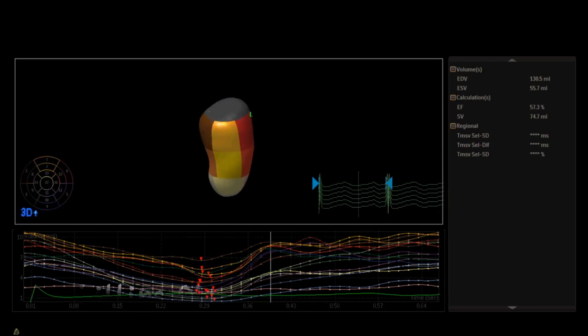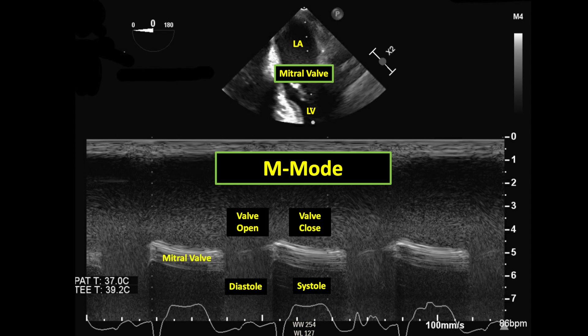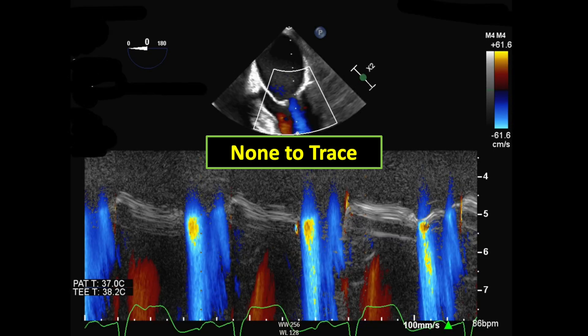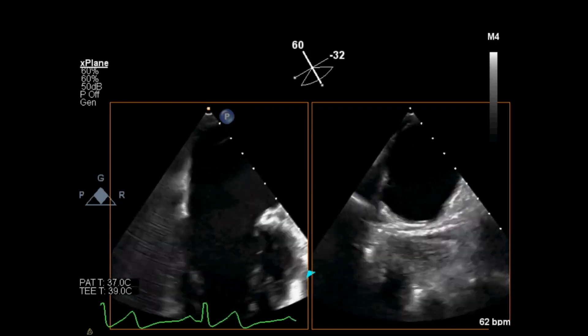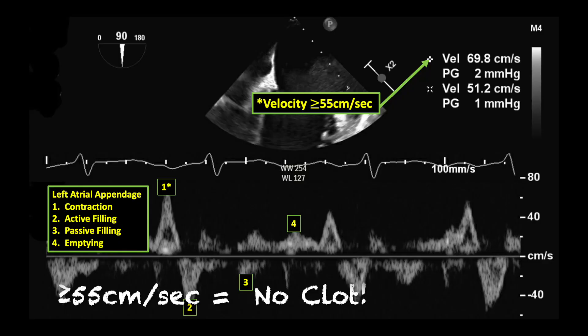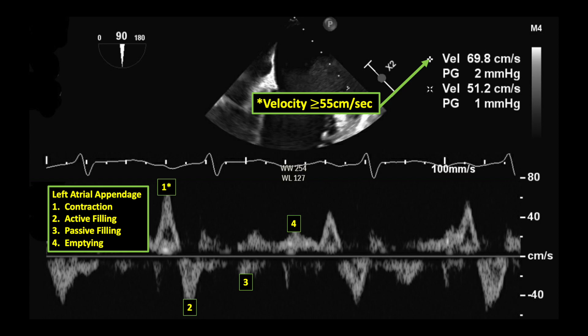In the mid-esophageal four-chamber view, I M-mode through the left atrium, mitral valve, and left ventricle, and assess the severity of mitral regurgitation or lack thereof. I go on to employ the pulse wave Doppler's range resolution capability and assess the left atrial appendage.